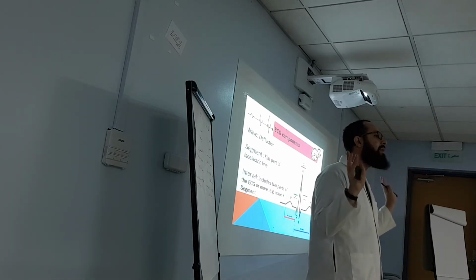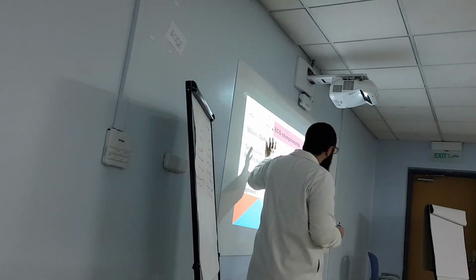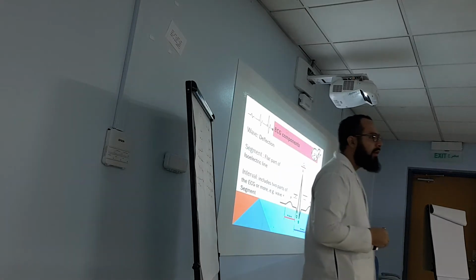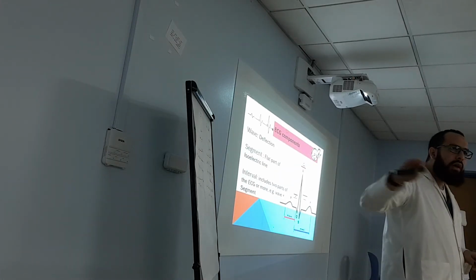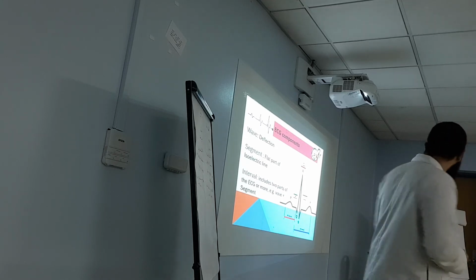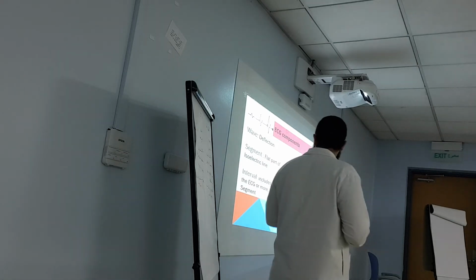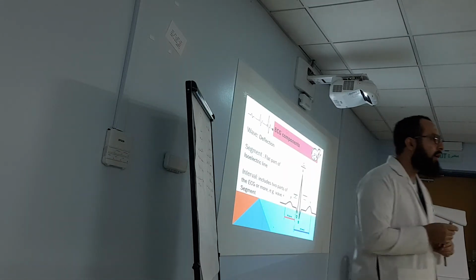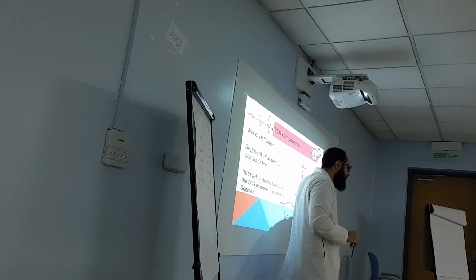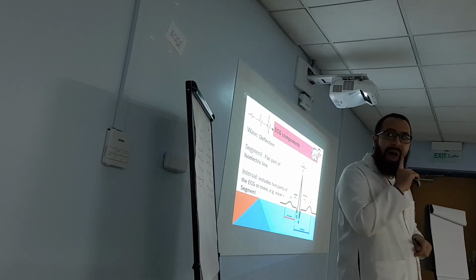It's like chemistry. So let's talk about other terminology. Wave: any deflection. A flat line is no deflection, no wave. Anything above the line is a wave, as I explained already. Segment: any flat part of the isoelectric line. Flat part. This is a segment. PR segment, ST segment. Flat line, not a wave.